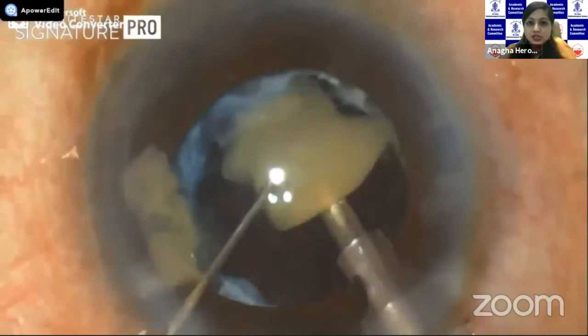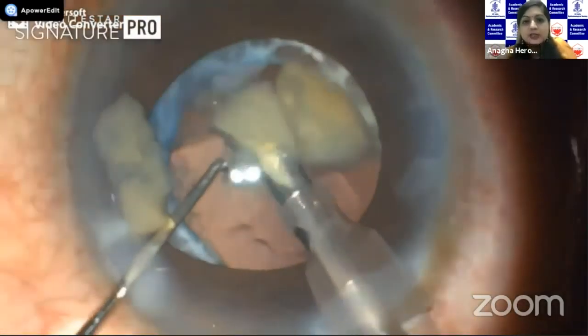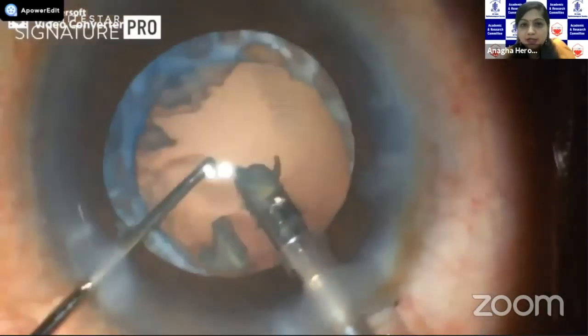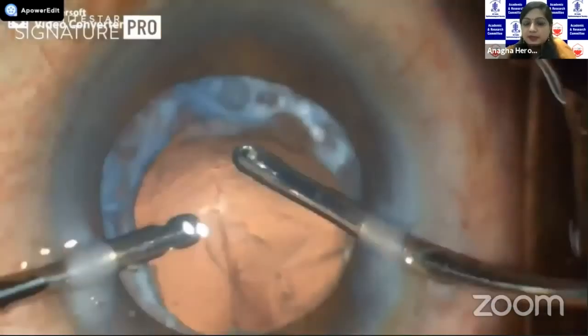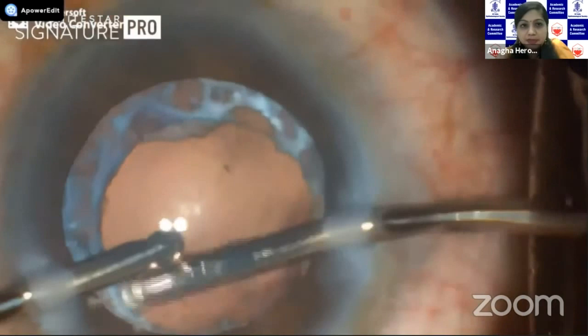You can see that the red reflex glow is not so good. As you're reaching towards the end of the phaco, you need to change the SCI mode — suddenly the glow is better and you can have good visualization of the posterior capsule. It's also important to reduce the vacuum settings towards the end to prevent any kind of surge and the risk of a PCR.